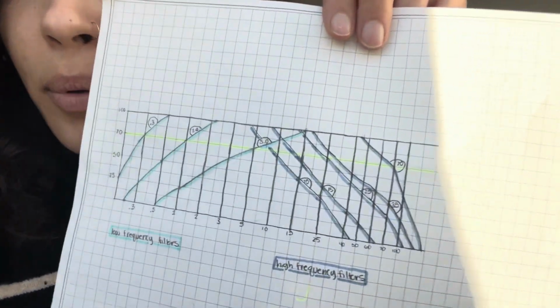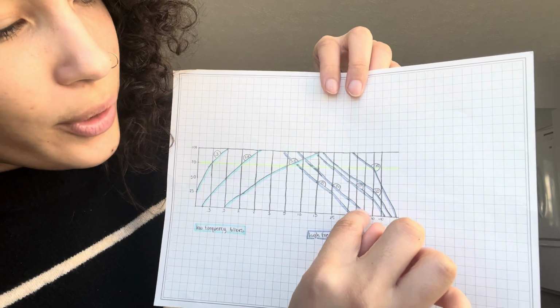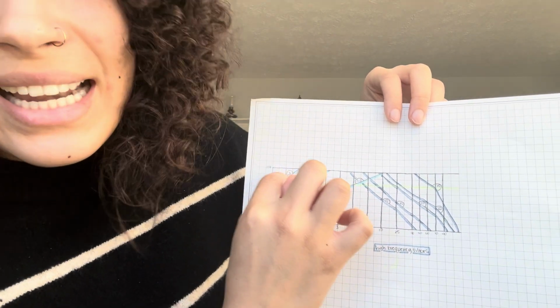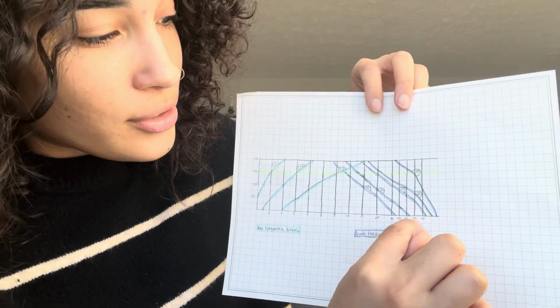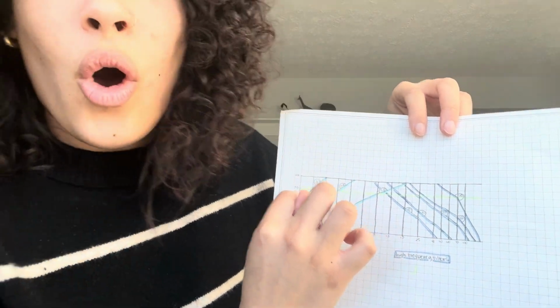When a patient has a lot of EMG artifact or muscle artifact, we can set our high frequency filter to 35 hertz instead of 70 hertz, and that allows us to filter out that faster activity so that we're only seeing things that are more likely to be cortical activity. So, for example, if we have 60 hertz showing on our study and we go up to our standard 70 filter, we are still seeing about 80 to 90% of that fast frequency. But if we lower our high filter to 35 hertz, then that 60 hertz is now only showing 50 to 60%, so it allows for a clearer image of the cortical activity.